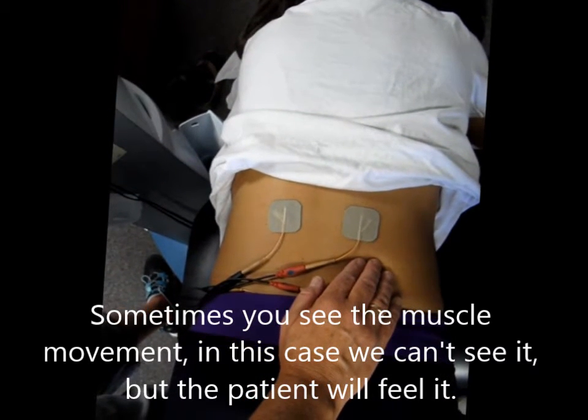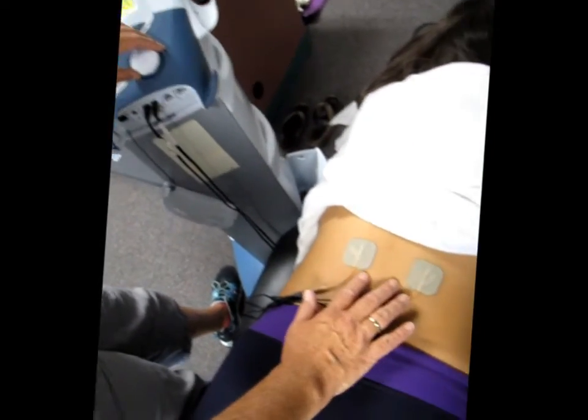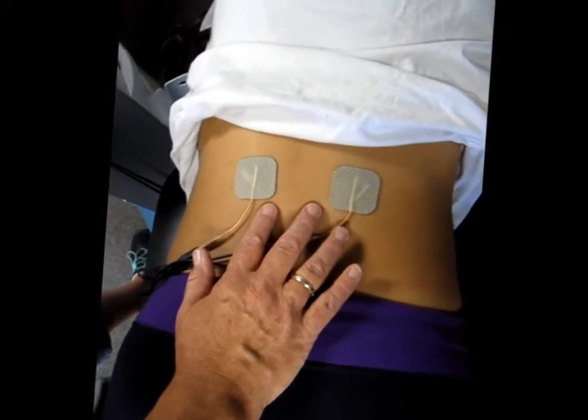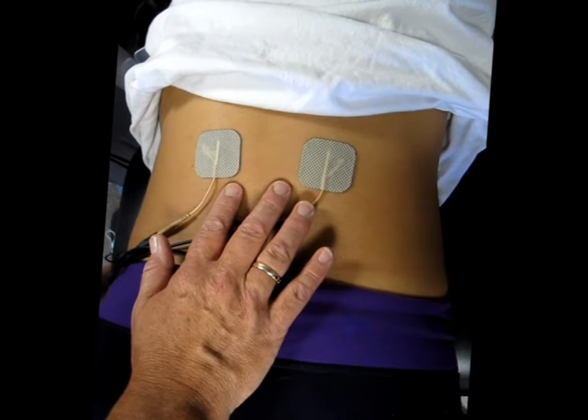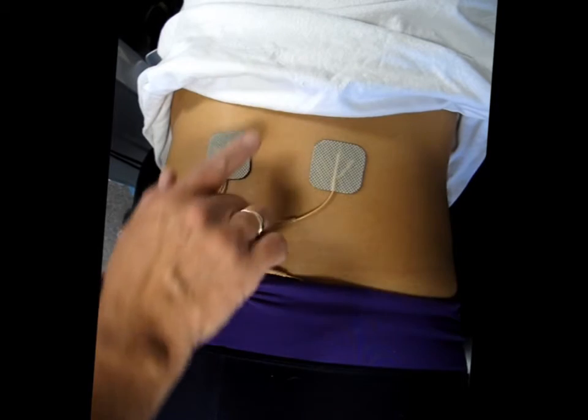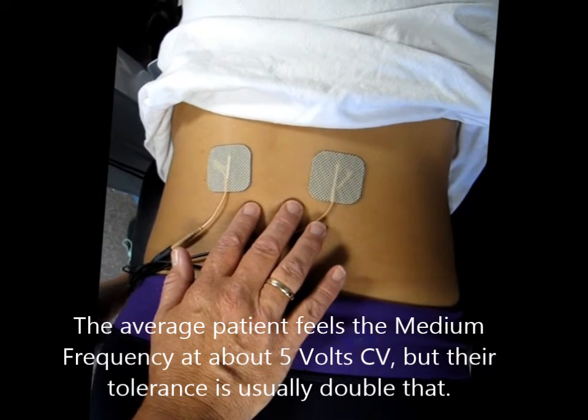We're up to 1.9. Do you feel anything yet? I feel a little. Okay, I'm going to see if I can get a twitch since it's visible. Tell me when to stop. I'm only at 4.6 volt CV. Let's see — her muscle is starting to get more visible right there. Is that too much or okay? No, that's good.